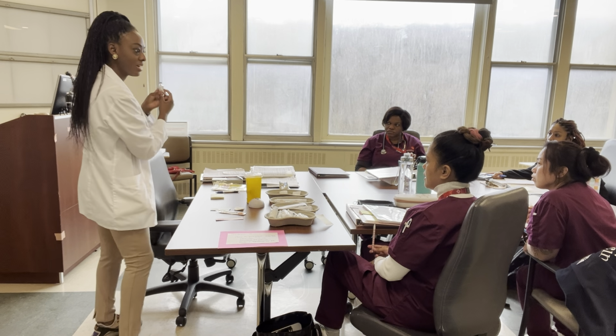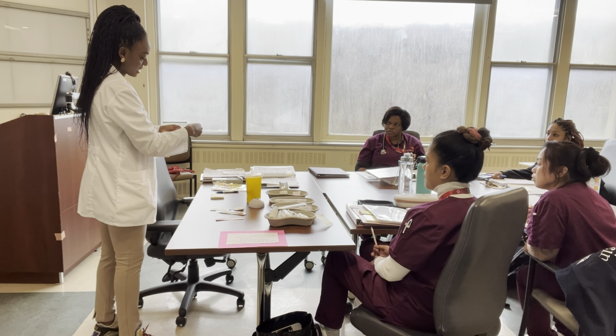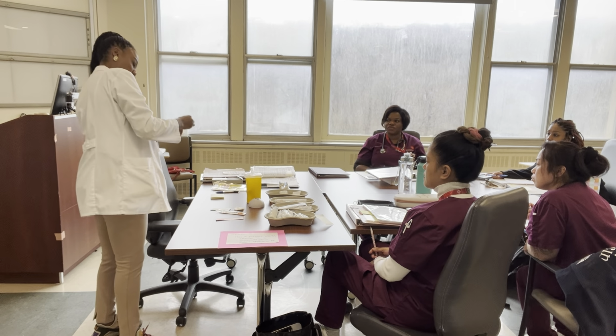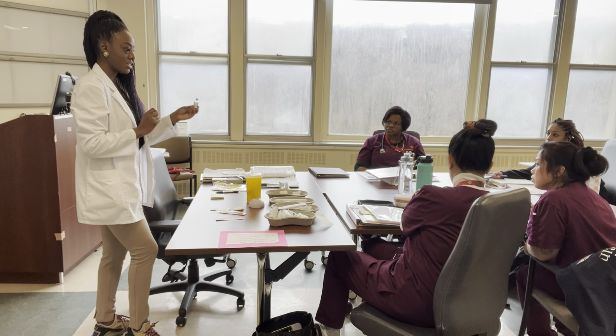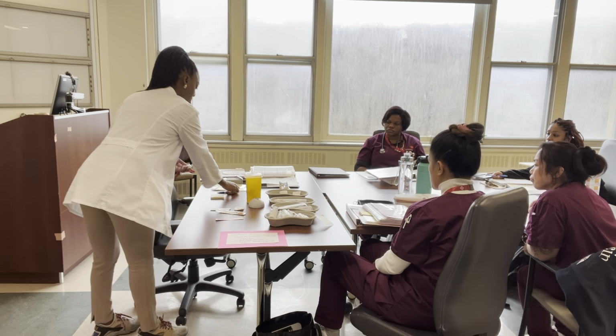What else do you look at on the vial? Expiration date. Okay, the expiration date. I agree. So 2027. Anything else? The time it was open. The date. The date it was open. Beautiful. So we don't have a date, so it's brand new. So who puts the date on when it's brand new? We do. So yes, I would put the date on.